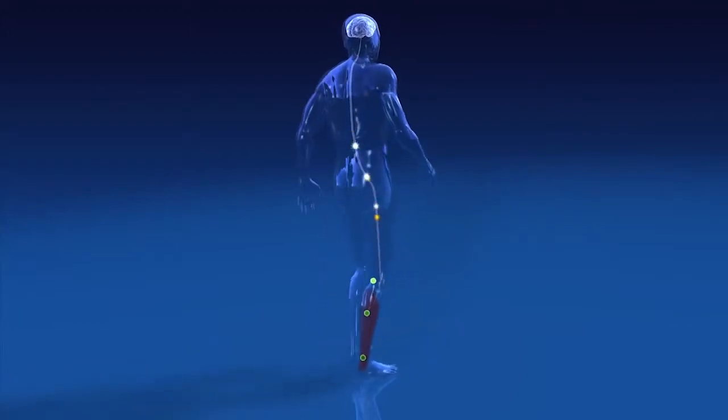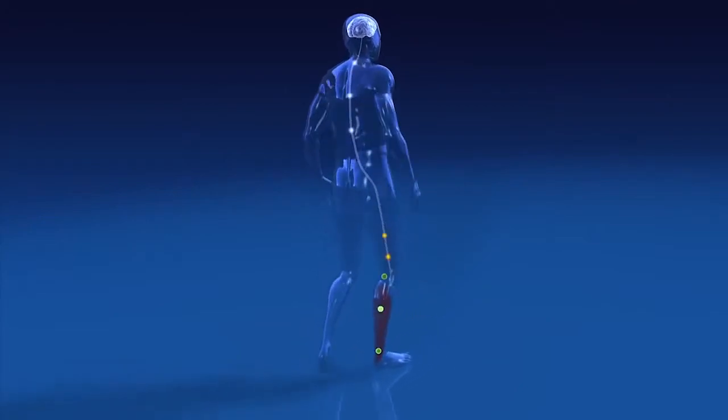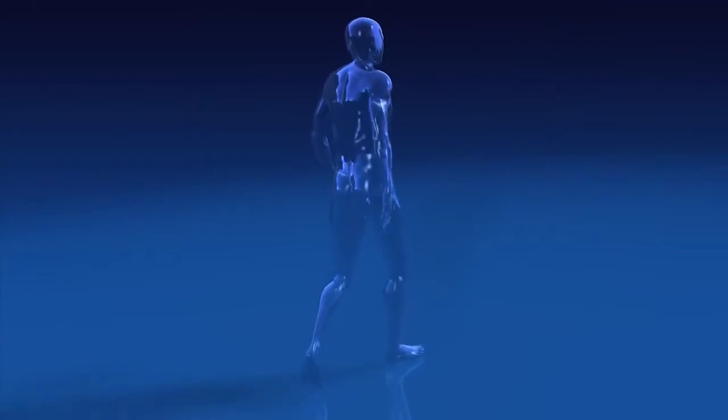Muscle activity and nerve stimulation are constantly interacting. This so-called reflex loop occurs approximately 20 times per second — in other words, the brain updates the movement around 20 times in one second.